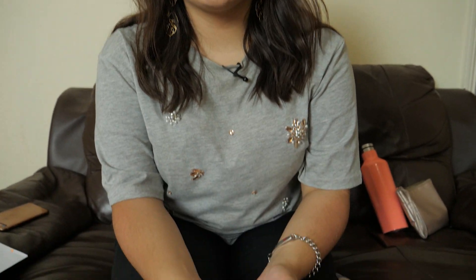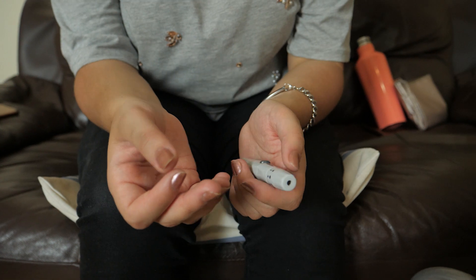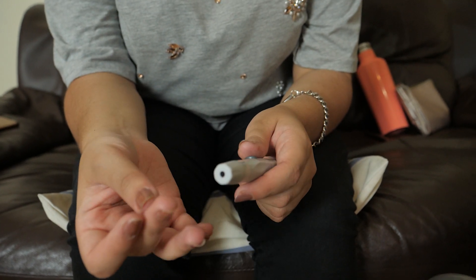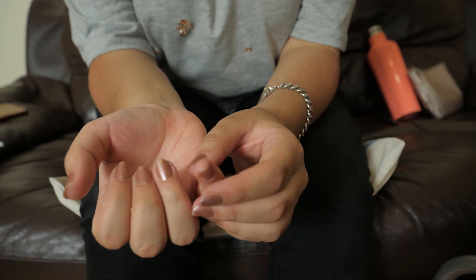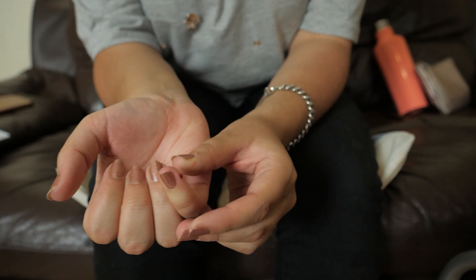Now you need to choose which finger to prick. Avoiding your thumb and your index finger, you want to use a different finger every time. Take your lancet holder and hold it to the side of your finger, avoiding the pad and the nail. A drop of blood should appear, but if it doesn't, just squeeze it gently until some blood appears.